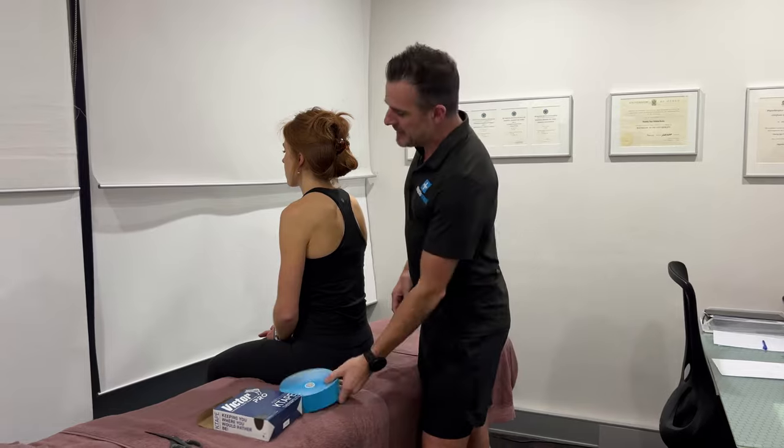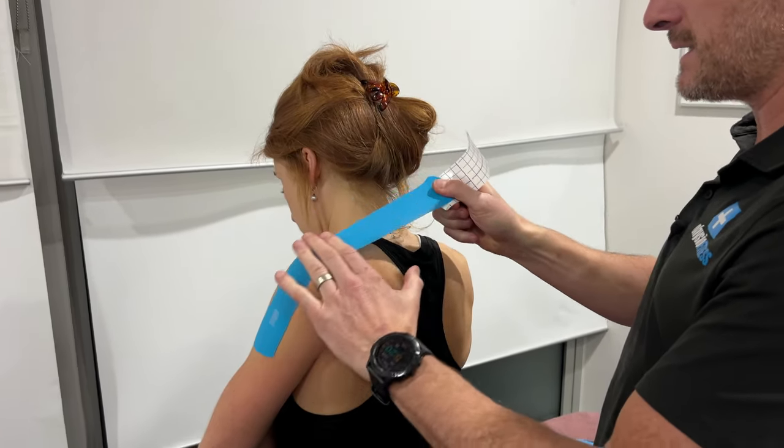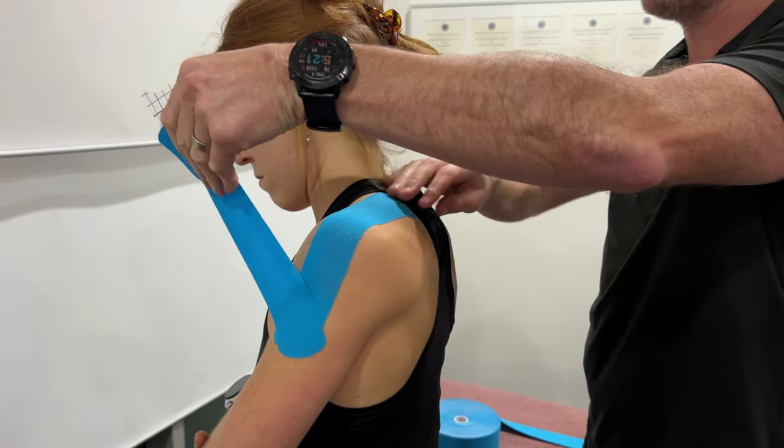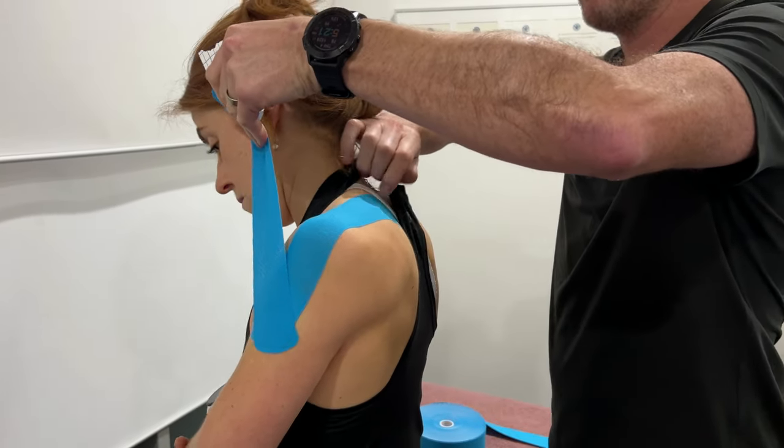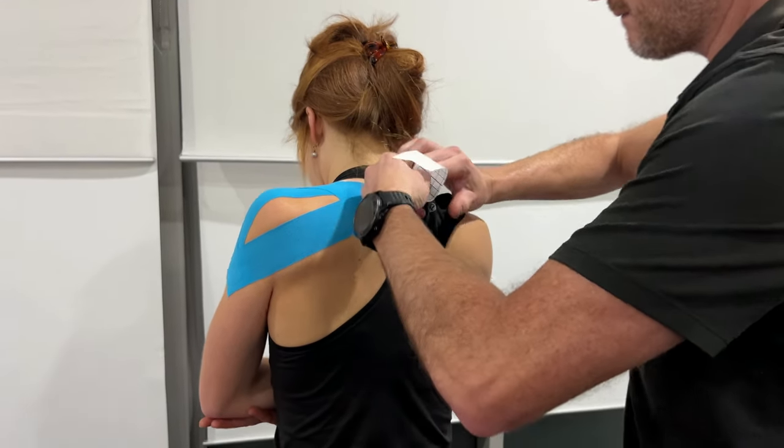Blue is today's flavor. I'll show you how to tape in the three directions that I do — from the back, the side, and the front — and show you what position that shoulder needs to be in to make sure that the taping is effective and takes all the weight out of their shoulder and unloads it effectively.